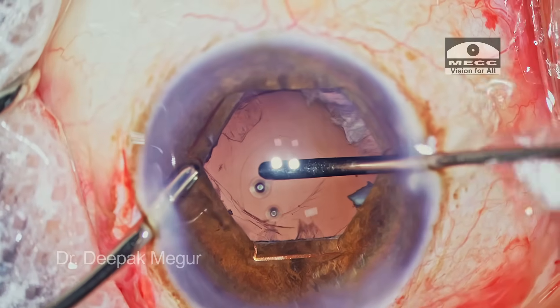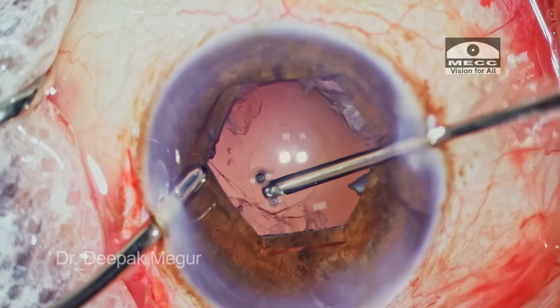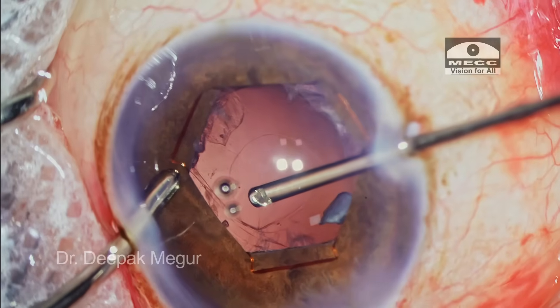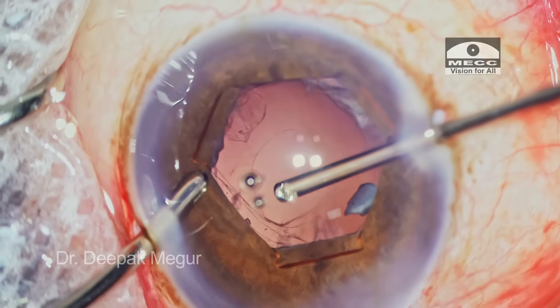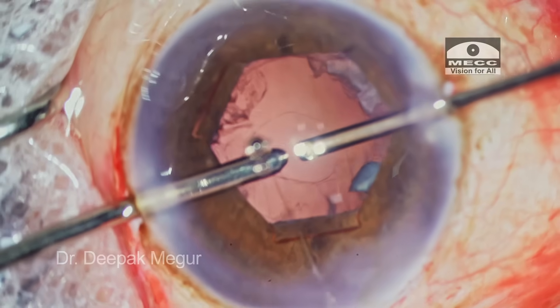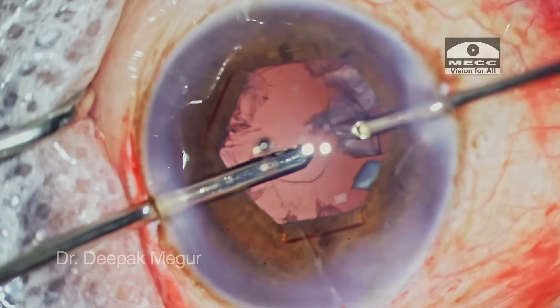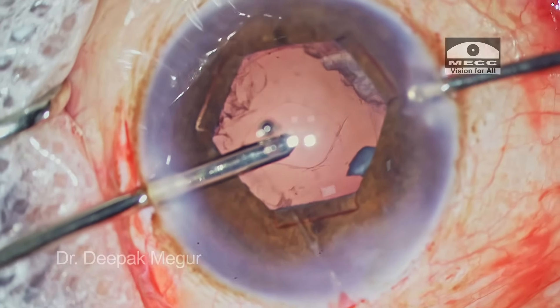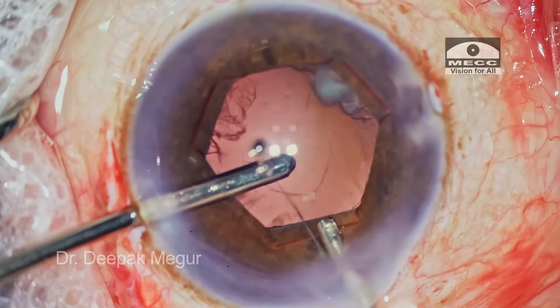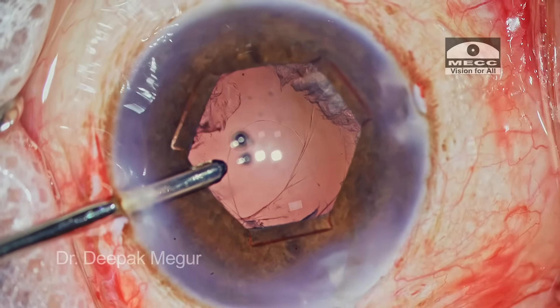Once I am certain that most of the vitreous around the posterior capsule is taken care of, now is the time to deal with the vitreous fibril running towards the main incision. With the second instrument, I negotiate that fibre and bring it centrally so it can be caught and cut with the vitrector. As this is being done, the lens material that had gone behind just floats up into the anterior chamber. This is the moment to pull it out of the eye — it just flows out through the side port, ensuring both small fragments have not gone into the vitreous cavity.